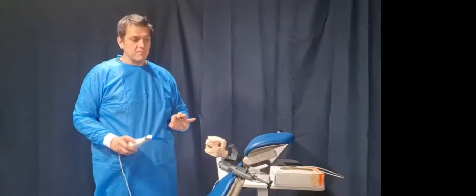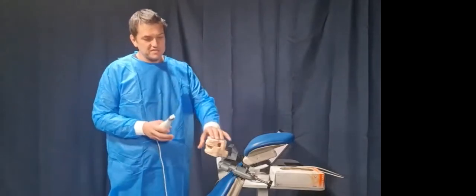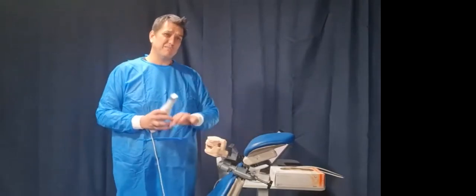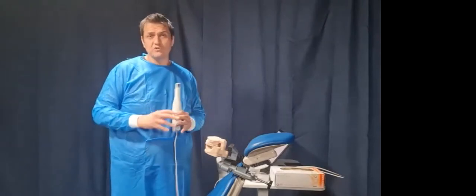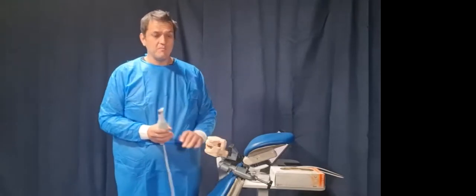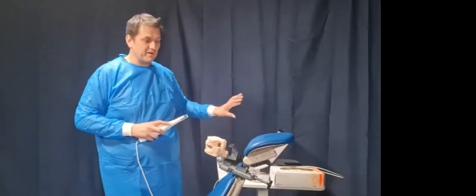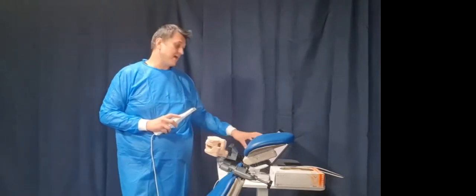And again, I want to show you a new aspect in 3Shape, which is actually fantastic. I got that update recently, and it's really, really good when you're using the manual relocation. I actually did get this one in the mouth, but let's see how we go with this one anyway, because I've done a few rehearsals and it's pretty tricky to get, but it will be a good illustration with the new aspects of the application that we can use together. I can show you that through our screen viewing as well.